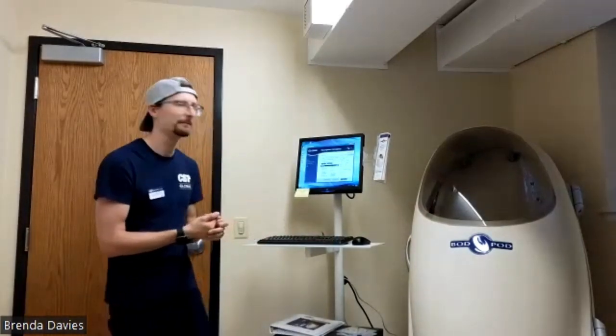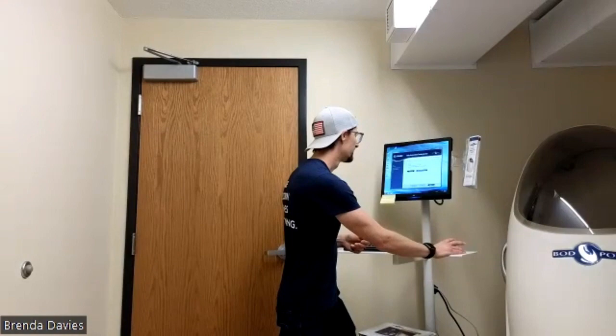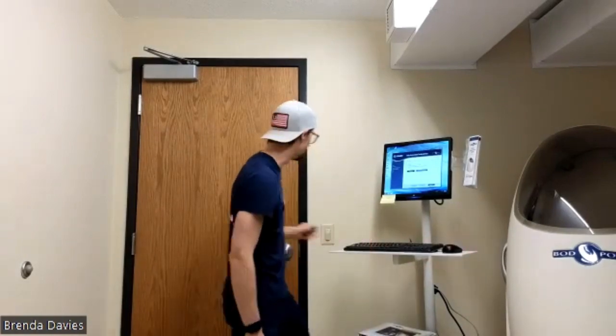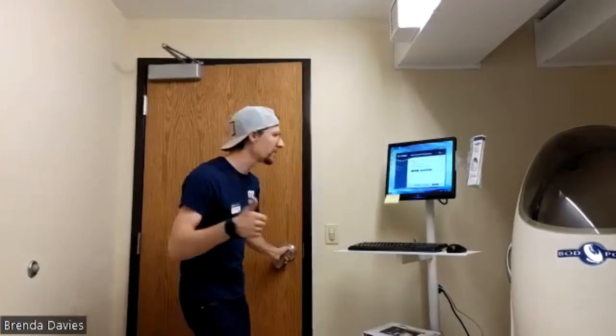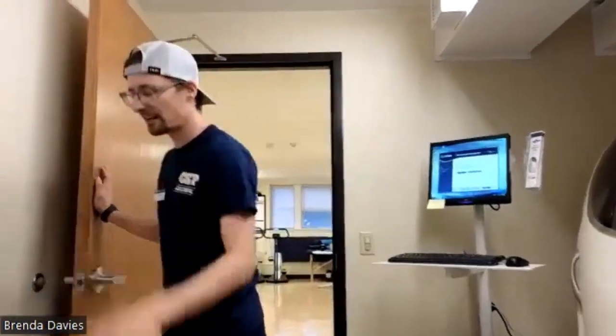Okay, thanks. Definitely. All right. It's getting warm in here. It is getting warm in here, I can tell, yeah. So, sweet, we did the bod pod. Good job. Hey, I don't know what your previous stuff was, but we can look here. Yes. Oh, sure, my foot.